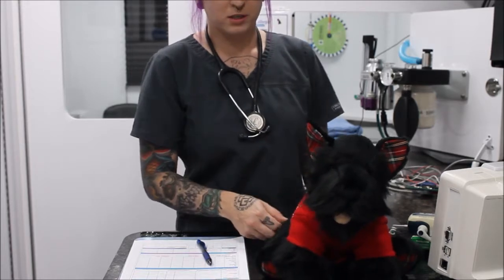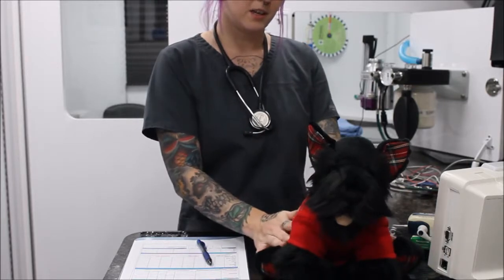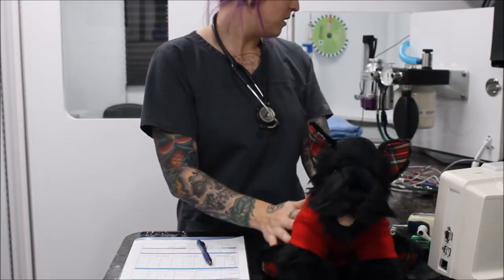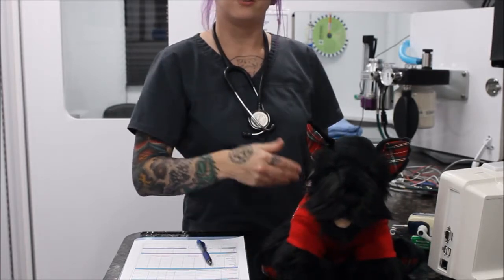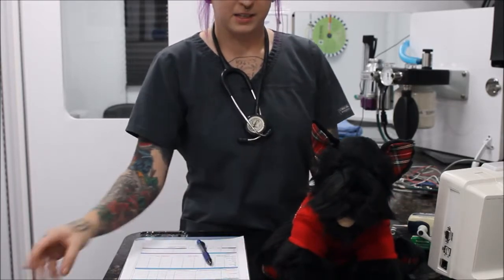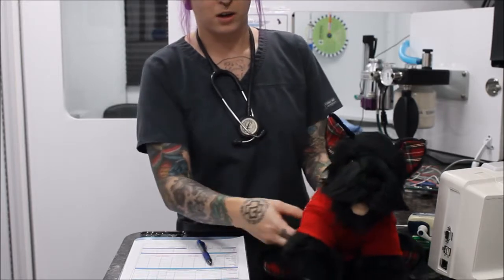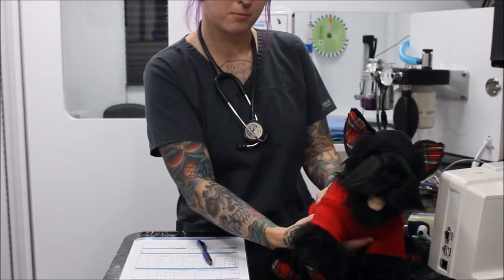So the first thing that we're going to talk about is heart rate. Heart rate is important, and it tells us basically circulation through the blood getting to the organs and the tissues. And the way we monitor heart rate is either by direct contact, so palpation basically in the thoracic wall and feeling for the beats per minute.